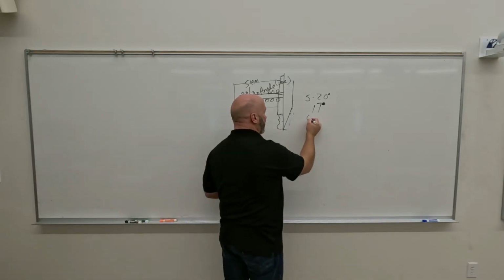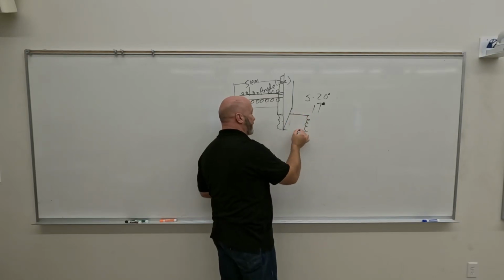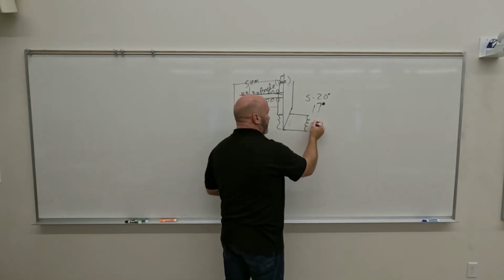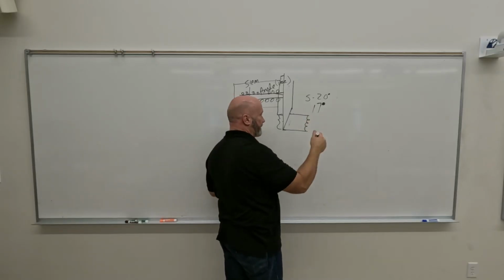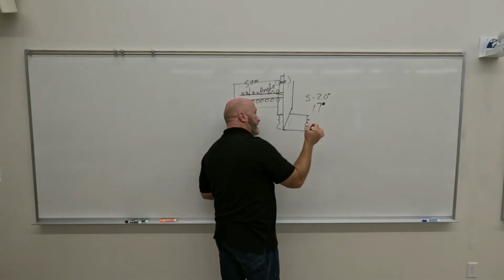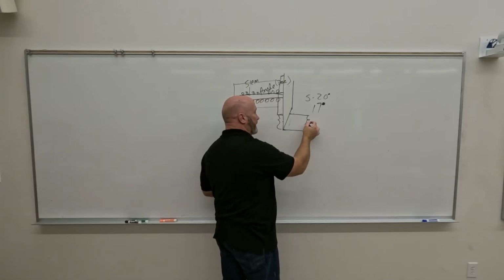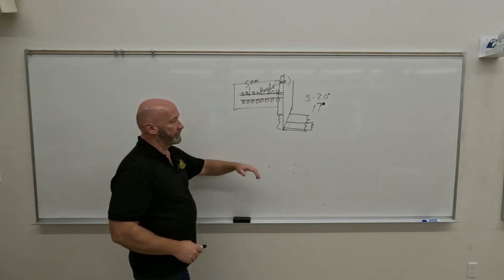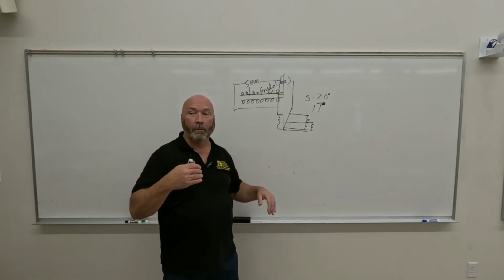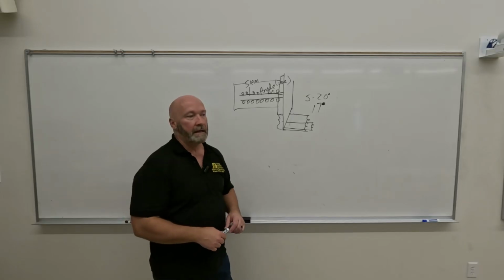One is the size of the filament. The size of the filament is going to control the area of bombardment. So if we have large focal spot, we'll press the button for a large focal spot, we energize the large filament. If we use the small focal spot setting, then we are going to limit the area of bombardment to a much smaller area. Okay, that's what we use to control sharpness of recorded detail, is just filament size.